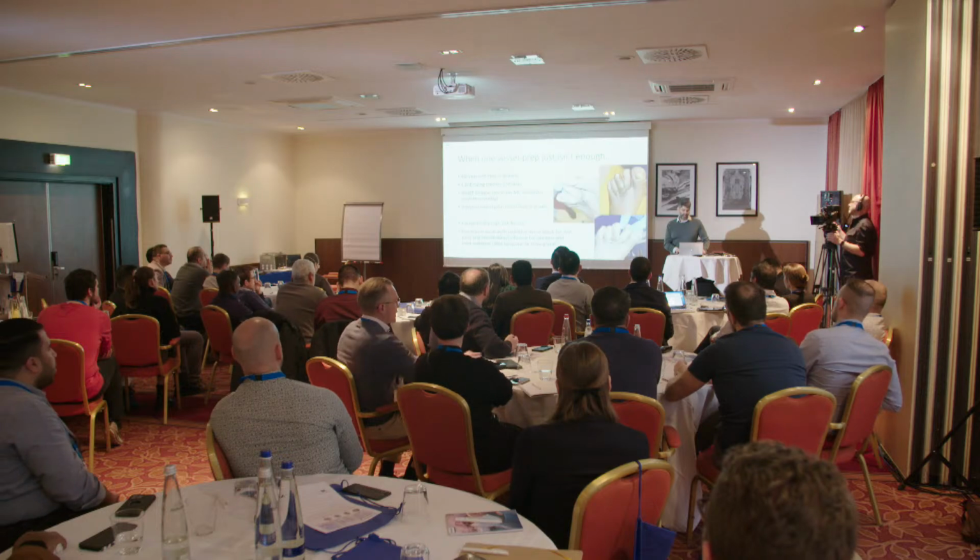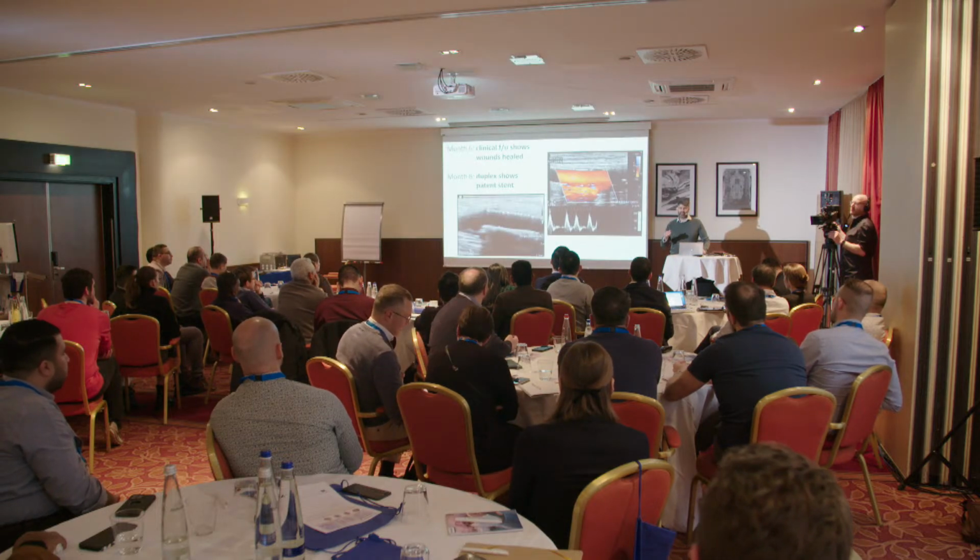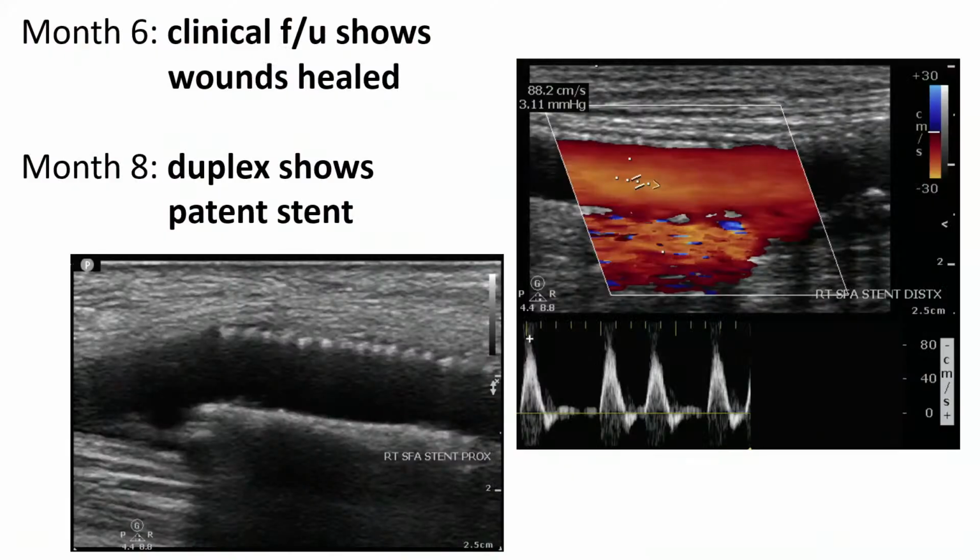There is a paper that has shown after atherectomy that you get an increase in the amount of reverb and a change in the pattern of the reverb, which we think means that, because with IVUS from the inside you can only see the inner layer of calcium, the reverb is what tells you what's happening to the calcium behind that very outer layer, and it shows that after atherectomy there's a change and an increase in the amount of reverberation. So something has happened to that calcium behind that: the ultrasound waves are bouncing within it a little bit more and then coming back to your transducer a bit later on.